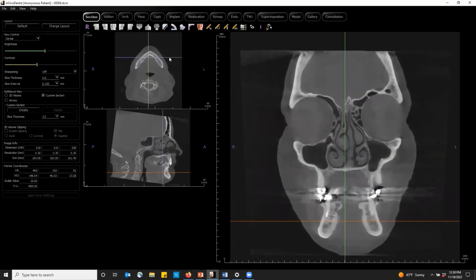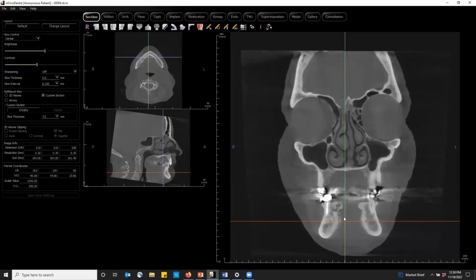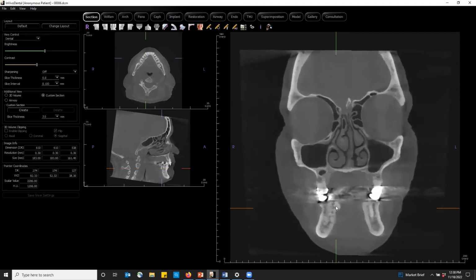As you're going through, you can see in that right mandible, some nice sequestral bone going on. And again, you can see that periosteal reaction, comparing that left side versus the right side. And this is where I was talking about earlier, of always having that bilateral, looking through things, looking for that symmetry.